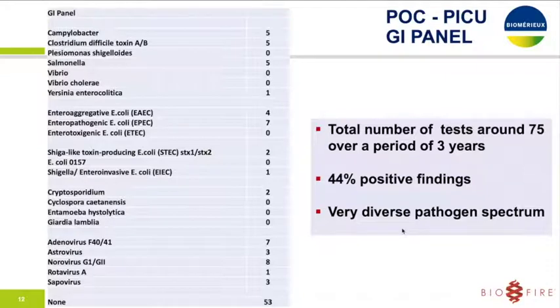And that, from my perspective, even underlines a little bit why it's so helpful to have a rather broad view on the patient and on the causing pathogen. Oftentimes in clinics, at least in the past years, we tried a more focused testing, but that causes repetitive testing, since if you fail with one test, you have to follow with the next and so forth. And that is, of course, a significant cause of delay in finding and identifying the causative pathogen.